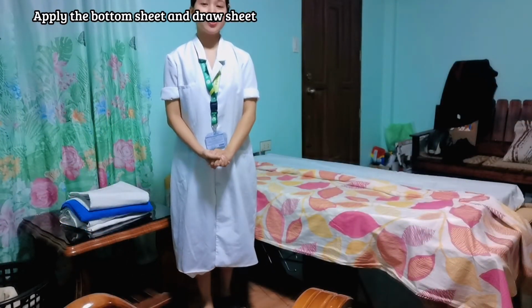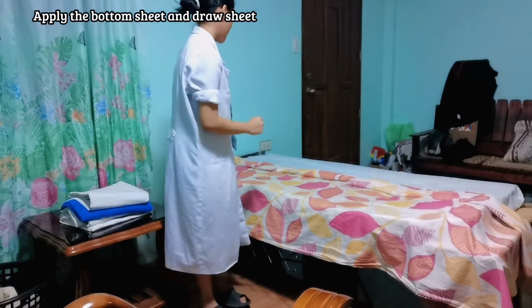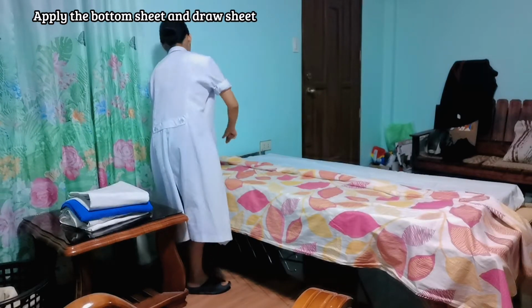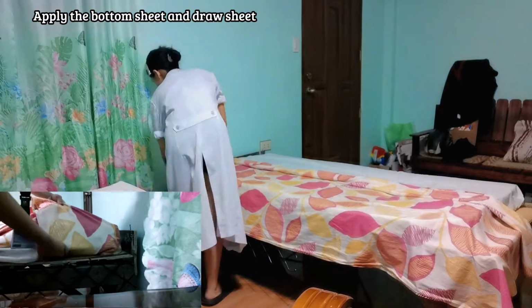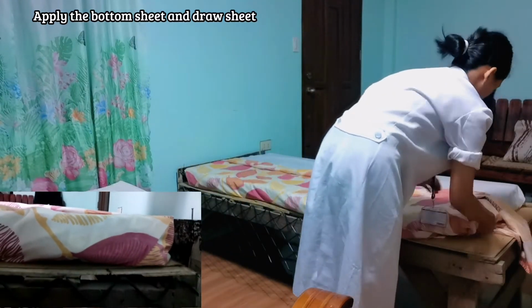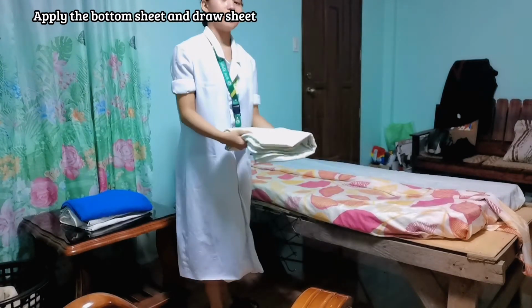And then we are going to tuck the bottom sheet under the mattress at the head of the mattress, and we are going to miter the edges. And then the rubber sheet.